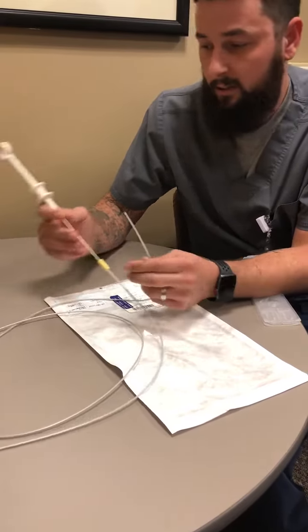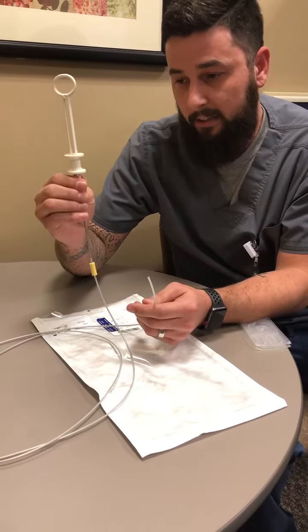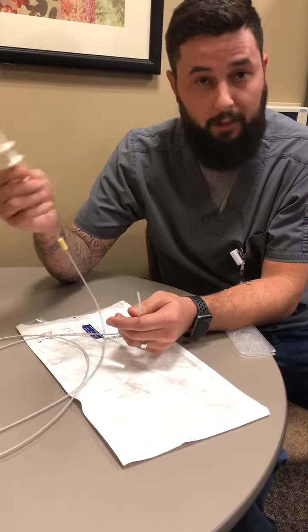The doctor will feed it down the scope. While they are feeding it, you want to hold underneath your handle, or else it might deploy your poly loop prematurely and you'd have to do another one.